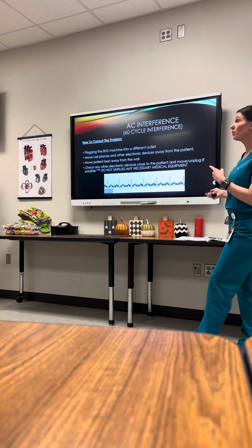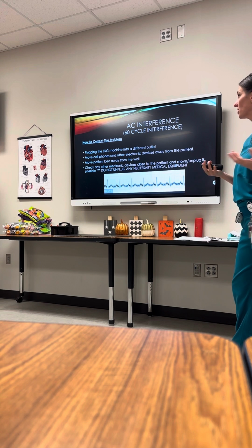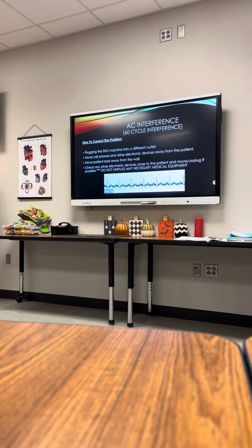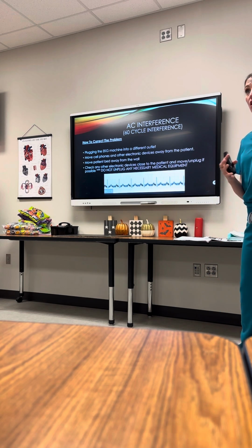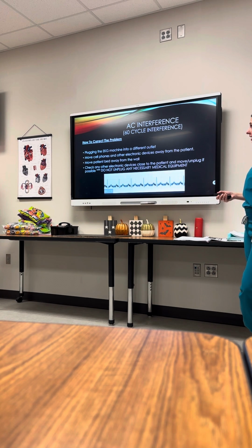So how can we fix this? What are ways to troubleshoot? How do we correct it? We can plug the EKG machine into a different outlet if that's an option. We ask our patient or physically help to remove any electronic devices that could be creating this artifact. Maybe we even move the bed away from the wall because that's where all the electronic things are plugged in. Check any other electronic devices close to the patient and move or unplug if possible. Obviously, you're never gonna unplug anything without knowing what it is and having permission from a provider, right? So never unplug any necessary medical equipment. Okay.